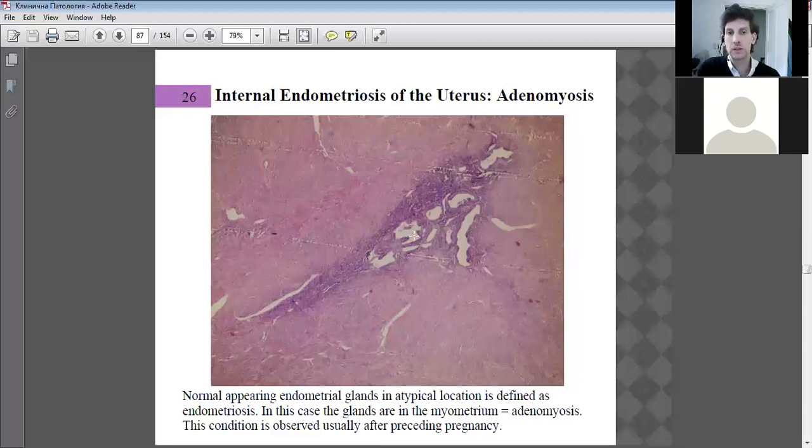So there is some stretching, if you like, of the uterine tissue. These holes eventually, once birth has happened, would all be repaired, fixed, by the normal stroma of the uterus.